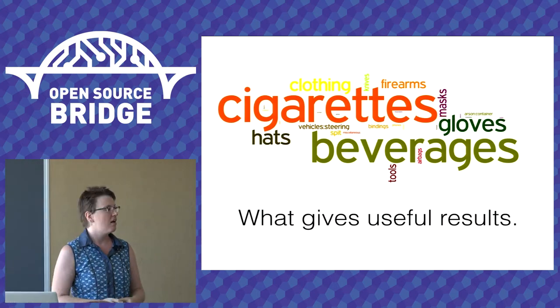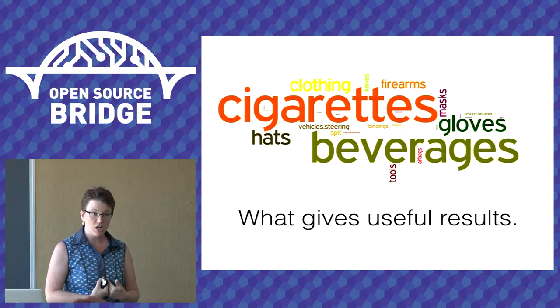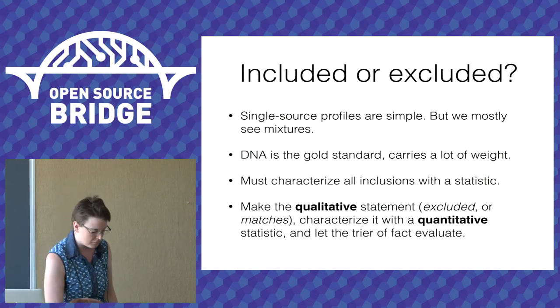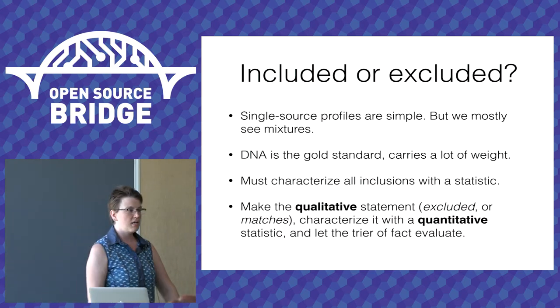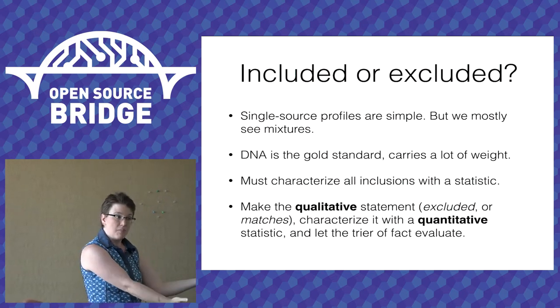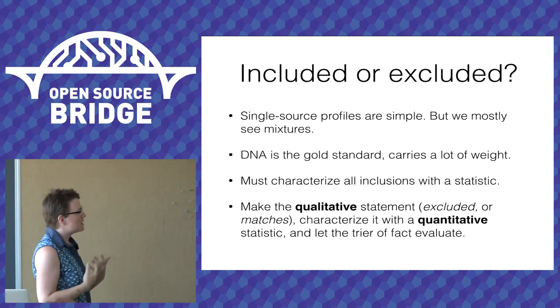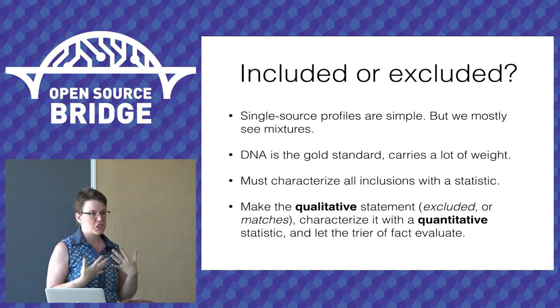It'll be great. Now we're going on to the mathy portion, but I'm not a mathematician or a statistician, so I'm just going to speak in high-level terms about the math that I do. No formulas. Okay. So I get a beautiful sparkling DNA profile off of a blood stain. I test the victim of the assault case, and I know his DNA profile, and they're a complete match. No problem. Beautiful. Lovely. That, like, never happens. It does happen. It happens about 10 or 15% of the time. The rest of the time, I get mixtures.